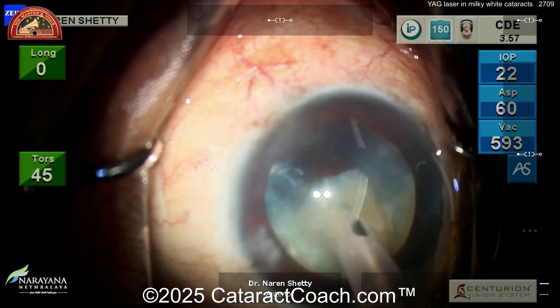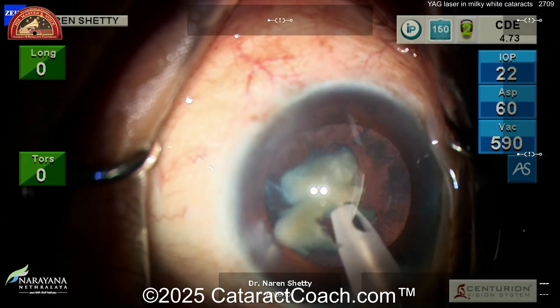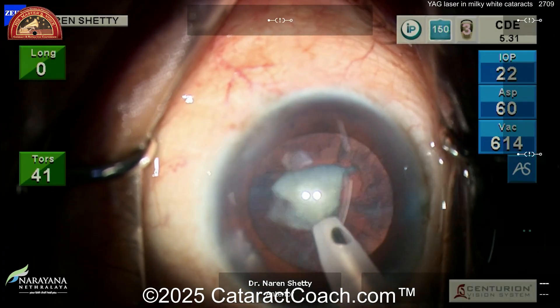After all the chopping and the pieces are small, you can just emulsify them pretty easily. And of course, this is the best miracle in all of medicine — you get a blind patient and you make them see again.